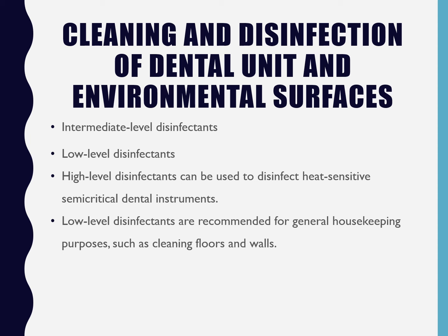I just want to say, I've temped in an office where I went in the morning and they gave me a RIN instrument, and I took x-rays on one person in the morning. Then when I went back and asked, "Hey, where do I find the other RIN instruments?" they were like, "Oh no, you use that same one. You just wipe it down." And I was like, what? And they said, "Yeah, we just wipe that down."